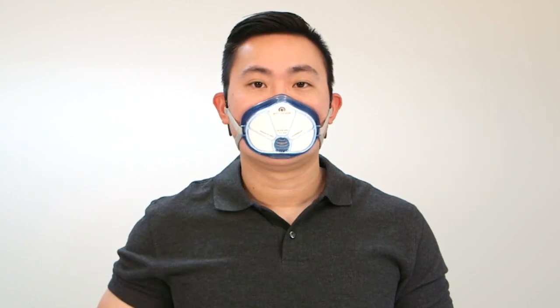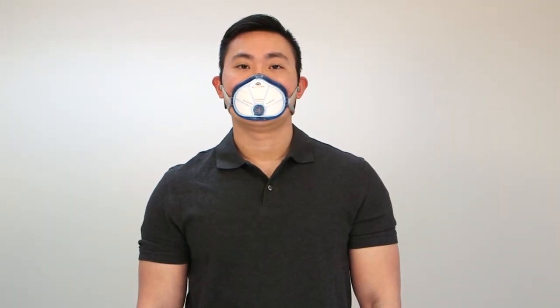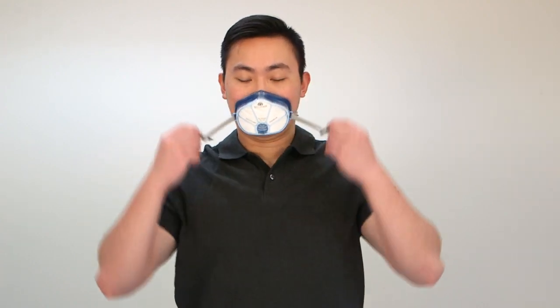For professional use, please refer to your company guidelines. After leaving the hazardous area, you can remove the mask from your face and hang it in a resting position on your chest.